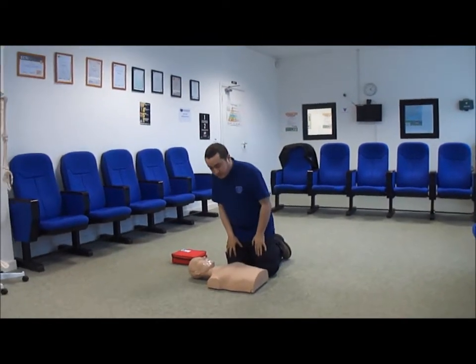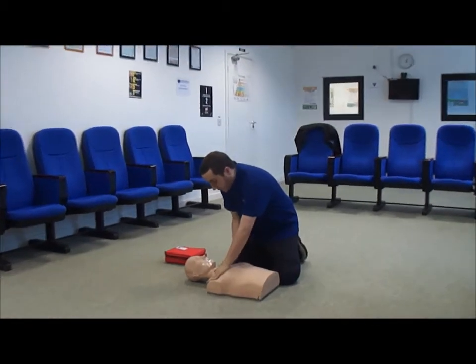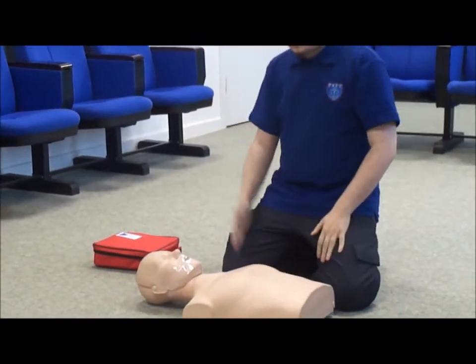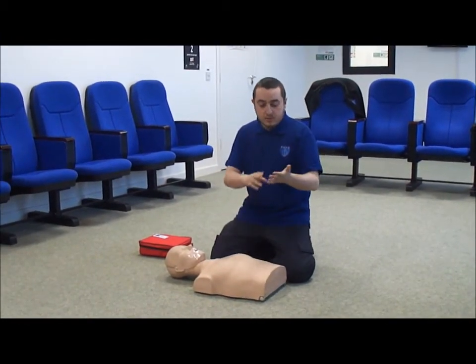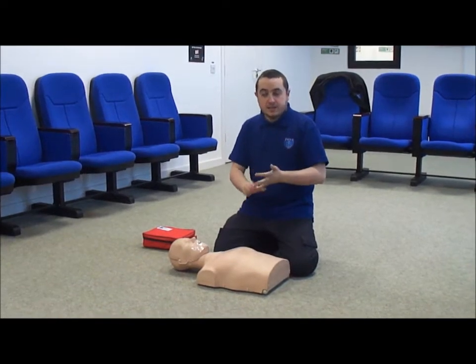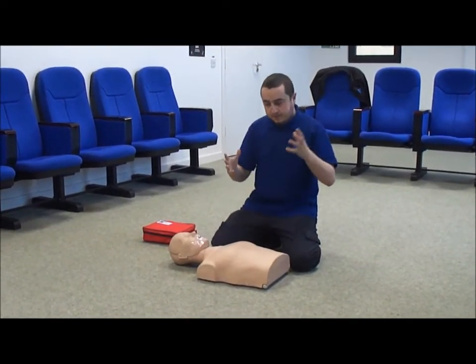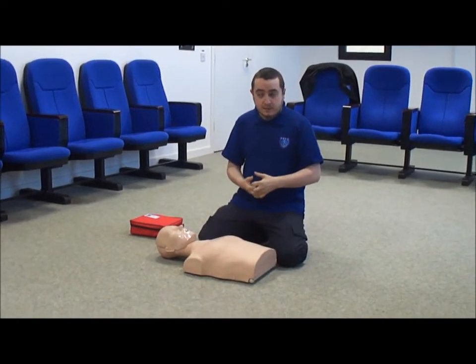So we get down to our patient and we're going to see if the patient is responsive. To do this we tap and say, hello, hello, can you hear me? Can you open your eyes please? If there's no response from my patient, I'm going to get people around me, if there are people around, to phone for an ambulance and see if there's an automated external defibrillator available in the locality. If I'm on my own, then I'm going to have to make this call myself.